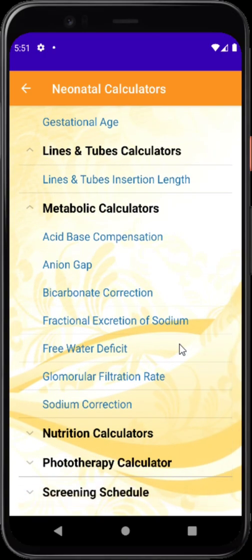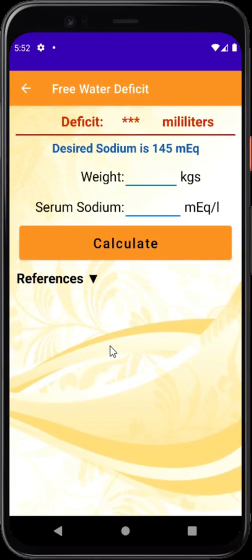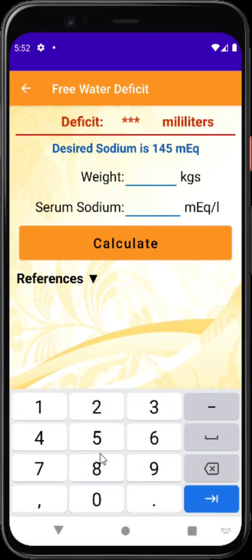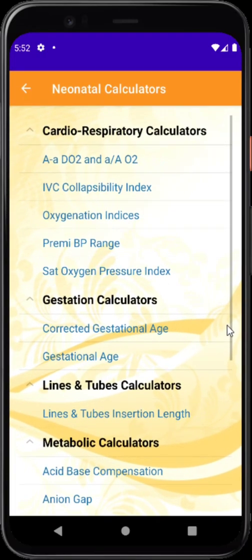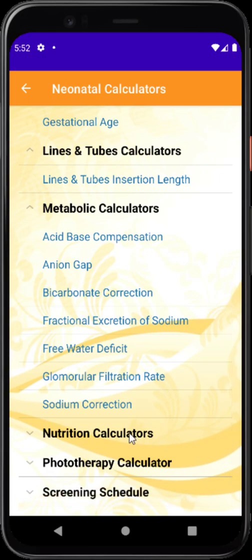Metabolic calculators are quite intensive — there are a good number of them and they can be used for management of very sick neonates. For example, for correction of hypernatremia with free water deficit, open the calculator, type the weight — in this case 1.2 kilos — and enter the sodium value from the lab, say 165. It then gives the amount of free water deficit that needs to be corrected.